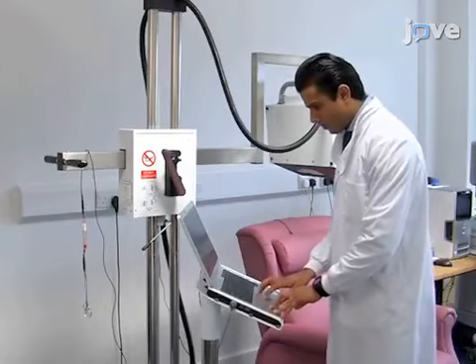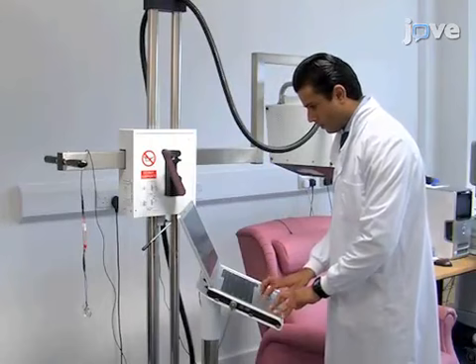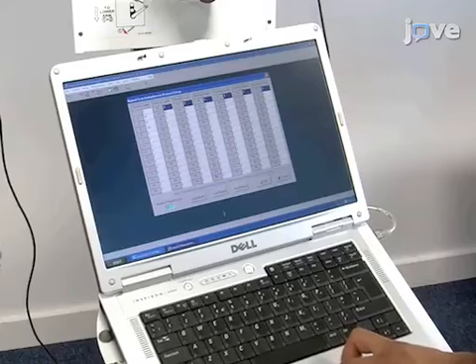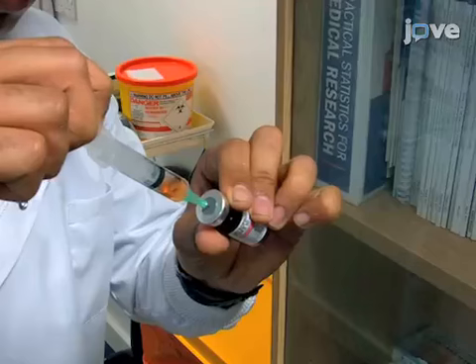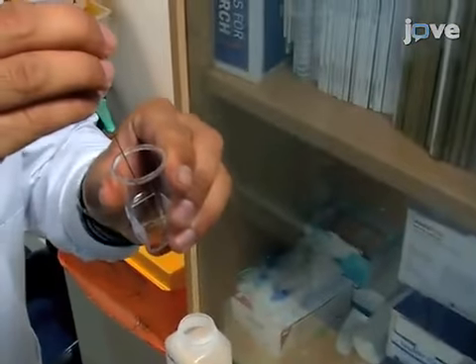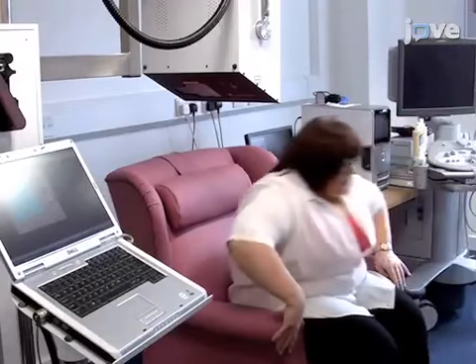First, prepare the laser Doppler imager. Let it warm up for half an hour or longer. Calibrate the machine and get the software ready to use. Also, prepare the solutions in the Perspex chamber. Then bring the study participant to the imager.